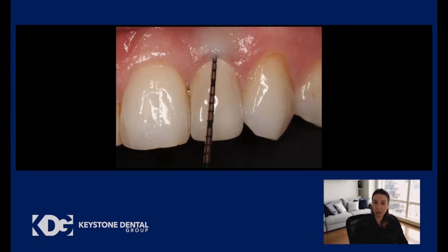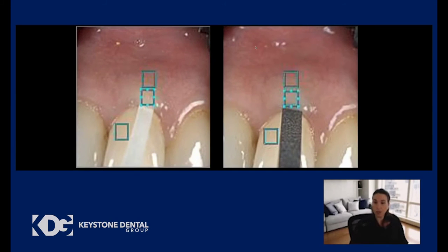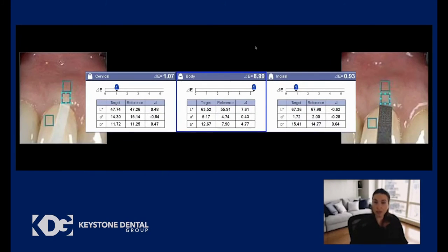Now let's take a look at a thin tissue biotype case. So you can see here the probe, you can see it through. But again, we wanted to be more objective. So we placed the papers the same way that we did with the thick tissue biotype. And here you can really see how that paper discolors the soft tissue. So we did the same measurements. And when we do the measurement, take a look at the body measurement, which is exactly here at the center of the soft tissue. The body measurement is now a delta E of 9, which is a much higher number than what we saw with the thick tissue biotype, which was 2. So this tells us that this case is a thin tissue biotype.